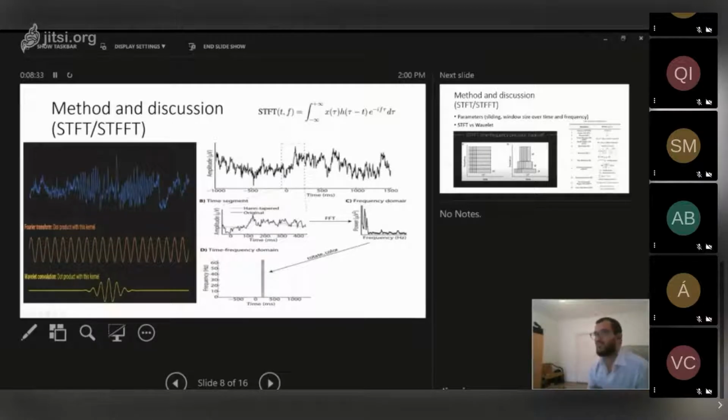But I mentioned wavelet because it's related to the short-time Fourier transform. They are doing the same things, but there's a difference. I will let you know a little bit later. Short Fourier transform is actually like wavelet. There is a small window on some part of your basic signal, and this is the signal extracted from that window, and then you apply Fourier transform to that signal to see a spectrum or power or energy inside of this signal.